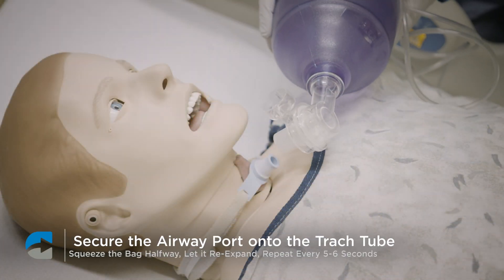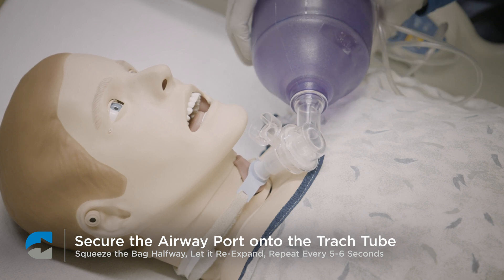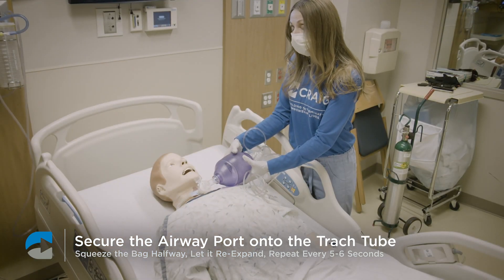Secure the airway port of the resuscitator onto the trache tube of the person. Squeeze the bag halfway and let it re-expand. Repeat this approximately every 5 to 6 seconds.